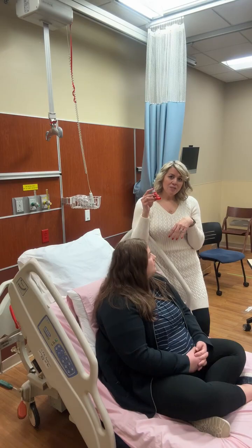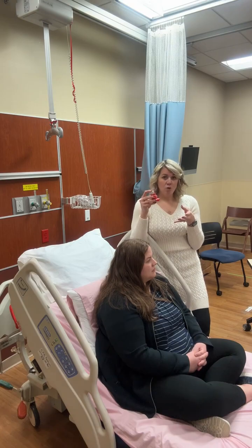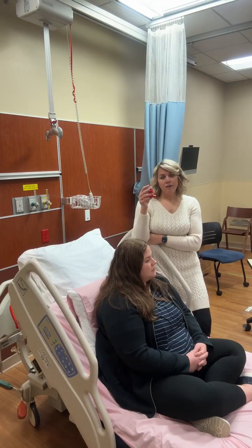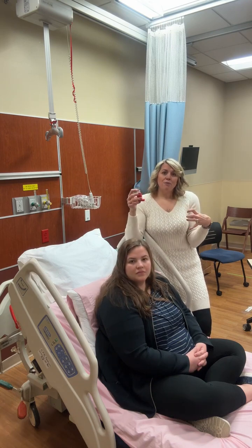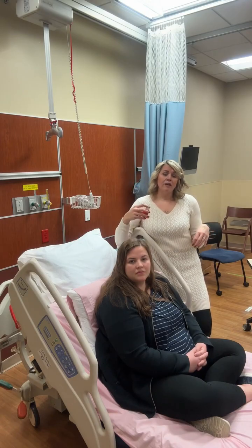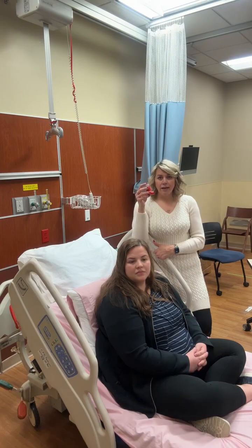When I'm instructing a patient on how to use this, I tell them they're going to use it based on what the doctor has ordered. Typically an albuterol inhaler is a rescue inhaler. It's fast acting and works right away. It's a bronchodilator, so it's meant to dilate the airways so they can take a deeper breath and allow more oxygen to get down to the alveoli. The same side effects can occur as with a nebulizer, so make sure you educate them on that.